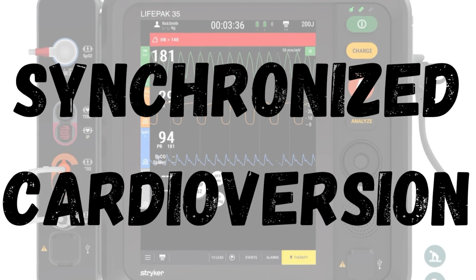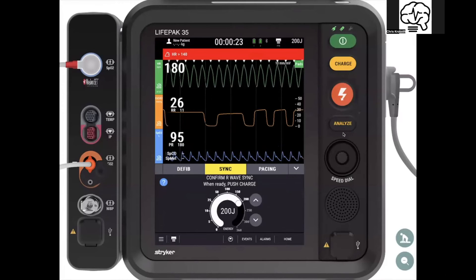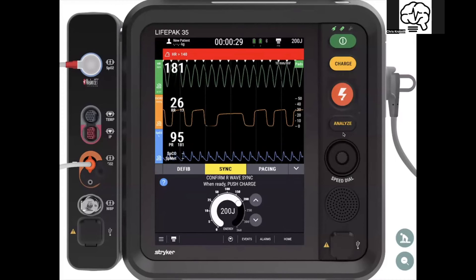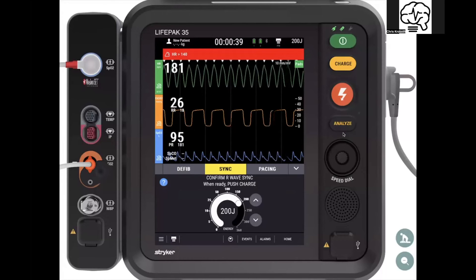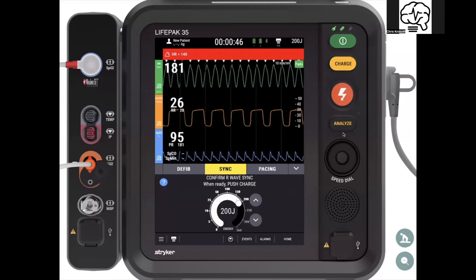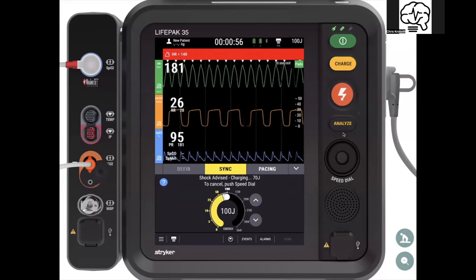Now let's talk cardioversion. Hit the therapy button, then sync. The nice thing here is once you hit sync, it keeps you in a nice linear path. In terms of human factors and problems that can occur under stress, your decision path is rhythm, sync, energy — a nice easy line for your brain to follow. We go down to 100 joules using the arrows or the dial, then hit charge. It shows the progress of the charge.